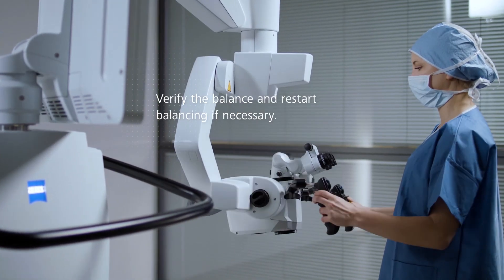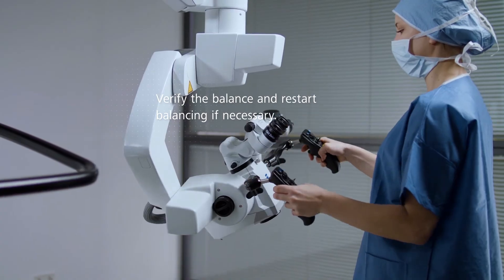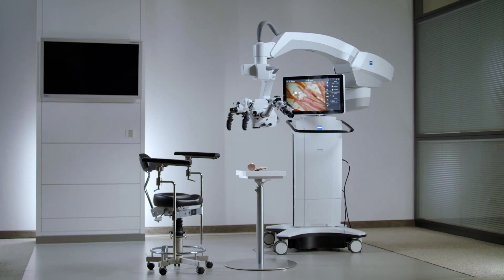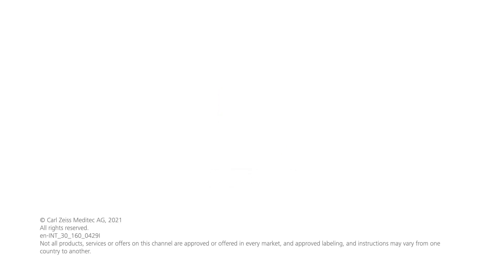Verify the balancing with the handgrips and ensure smooth movement in all directions. Repeat the guided balance workflow if the device drifts in any direction. The Tivato 700 from Zeiss is balanced, can be draped and used for surgery.